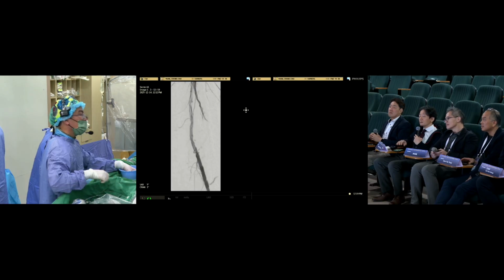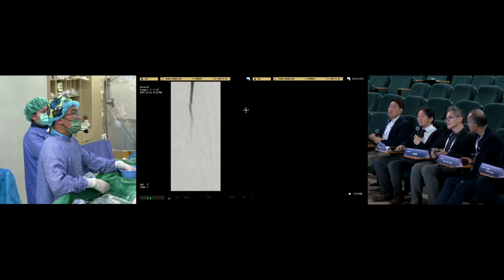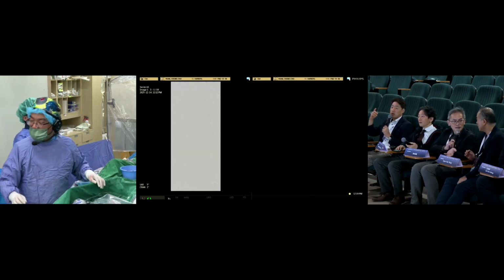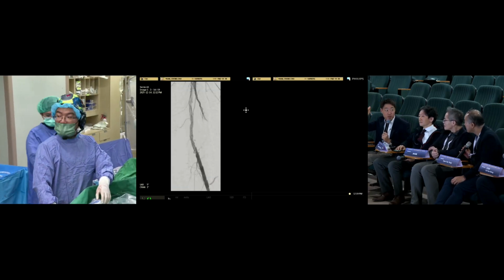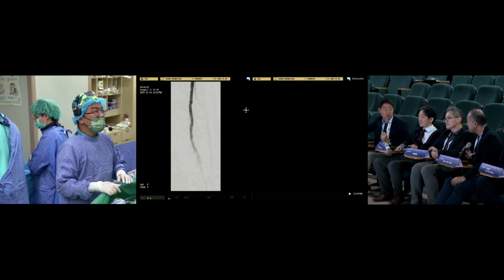Yeah, so there is a short Eluvia stent. It seems to be. Yeah, a short Eluvia stent. Okay. This was what I was mentioning earlier: the 7 millimeter stent would inevitably be partially covering the femoral bifurcation, because the stump is non-existent. Exactly.